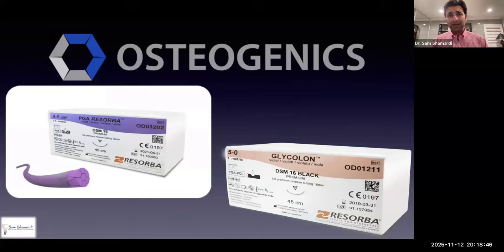But there are two very high-end, high-quality, absorbable resorbing sutures that we'll find on the market. Our friends at Osteogenics make one known as PGA Resorba, which is very similar to a Vicryl, and another material known as Glycolon. These materials are extremely tissue friendly. They have very good tensile strength, which means when you tie them off, they're going to be able to keep their rigidity there for the overall healing process.